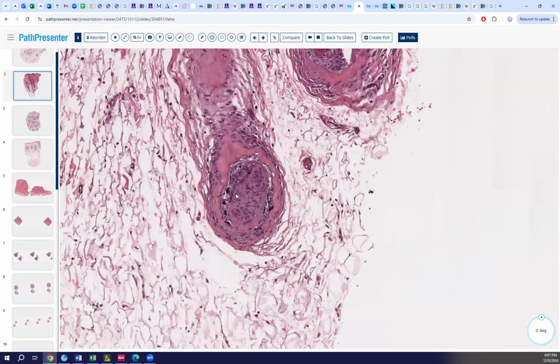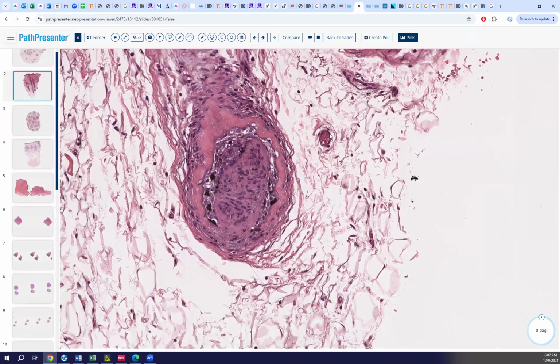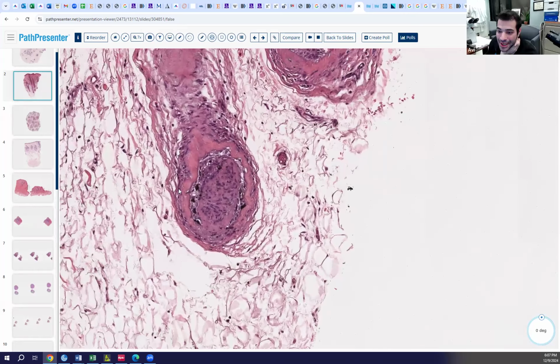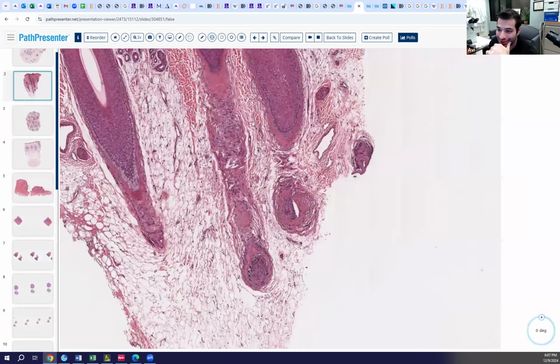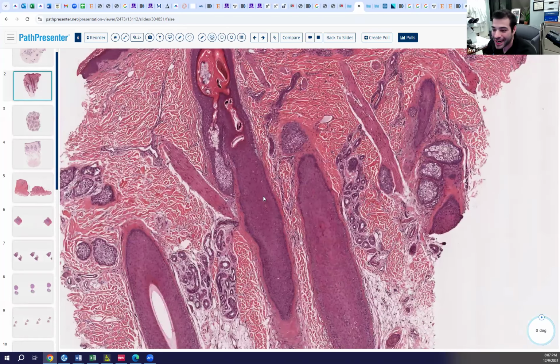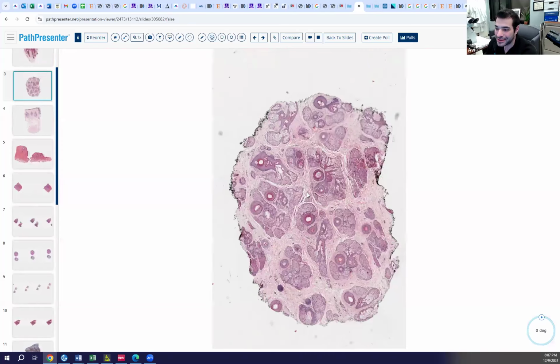To differentiate between trichotillomania and alopecia areata, we could go to the hair bulb. There looks like a swarm of bees. Where? Nowhere, exactly. Okay, so we're probably favoring either traction or trichotillomania in this case. This ended up being trichotillomania, but that's the way to approach that.